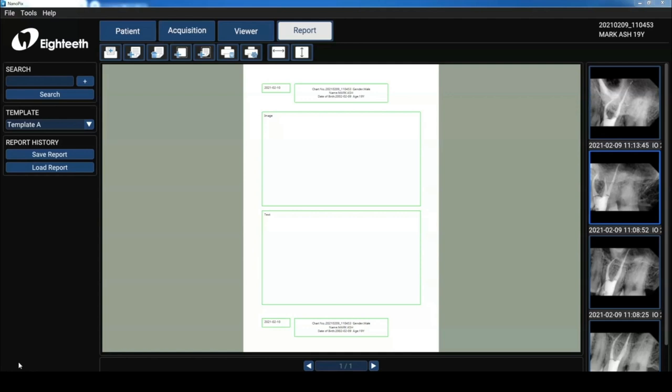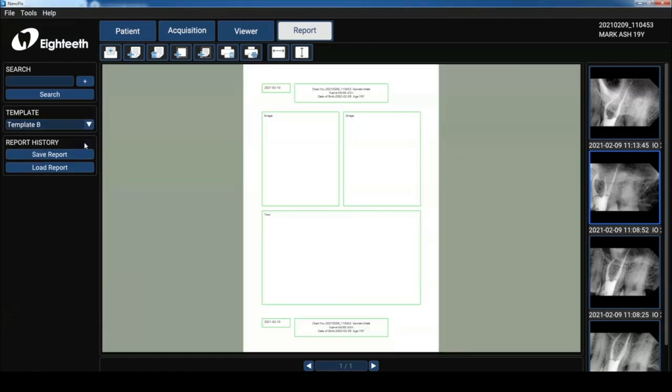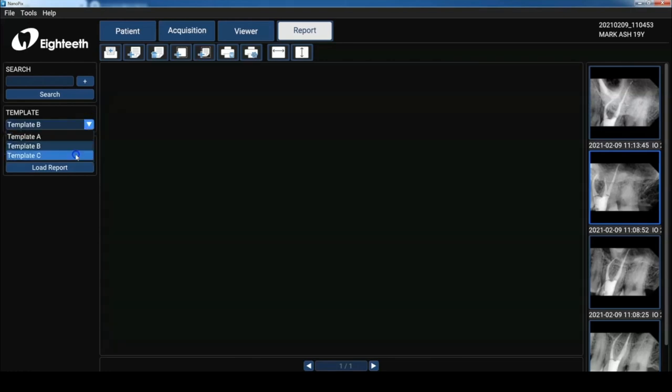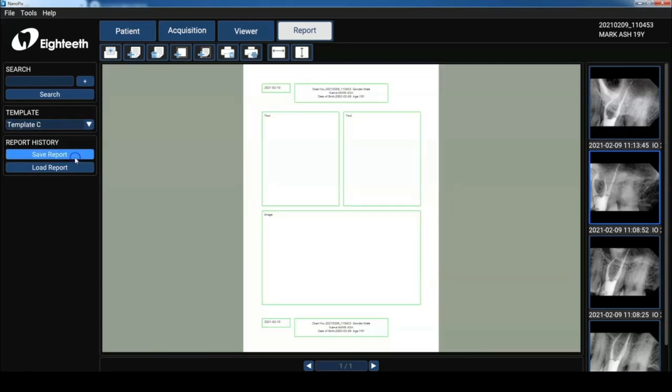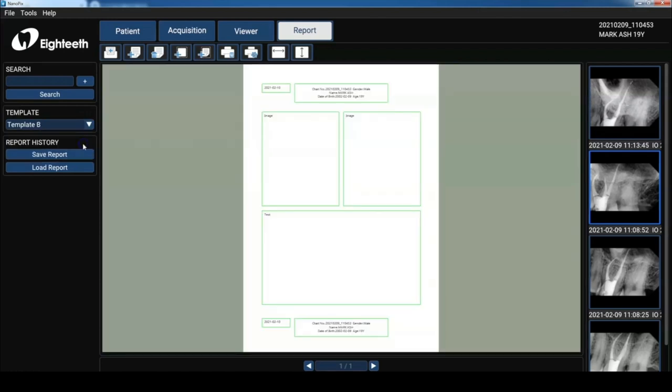So let's take a look at some of the functions. This is template A. It has an image on top and a text box below. And then template B has two images and a text box below. And then template C has two text boxes up top and an image below. I really like using template B.